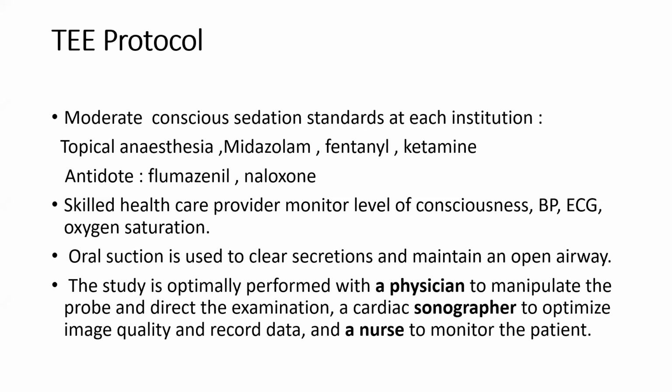And if you think the patient went from moderate sedation to deep sedation and his saturation became low, less than 90, this is a serious problem. You have to correct it, you have to revert him immediately with flumazenil and naloxone. And of course, you have to have a nurse with you, and sometimes you need a sonographer or another doctor with you to acquire the views.